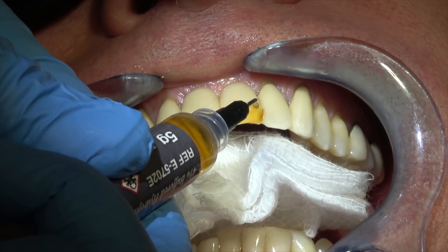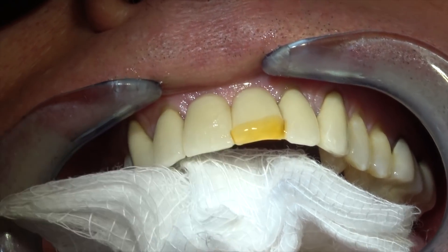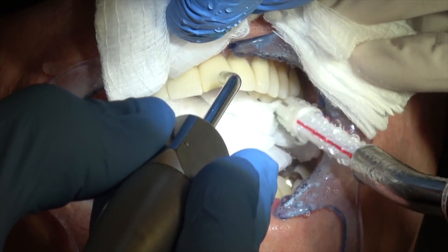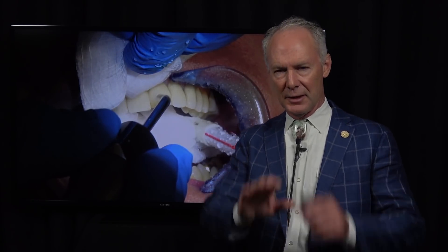This is four percent buffered hydrofluoric acid, and it's specifically for porcelain. Place that on the fracture site for about two minutes, then suction it off, and then rinse it off really well with your air-water syringe.